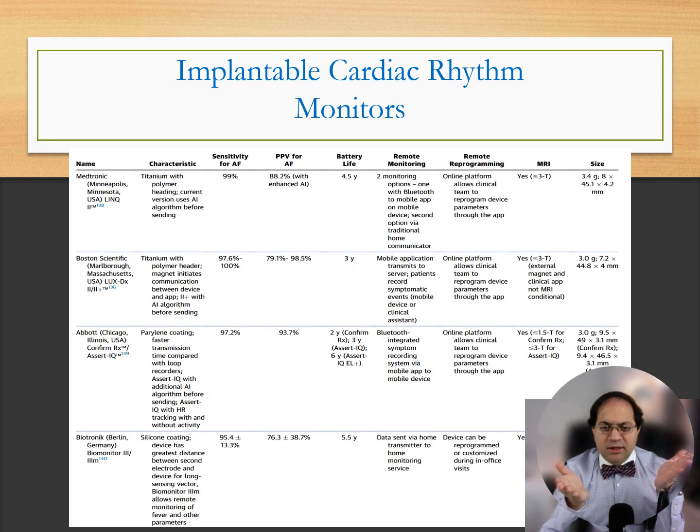And finally, we're going to talk about implantable cardiac rhythm monitors. As you see, we have 4 companies. Basically, Medtronic was a pioneer, with the Link, and Boston Scientific with the Lux, Abbott with different types of loop recorders, and finally Biotronik with the latest BioMonitor 3. They all have many years of battery, between 3 to 5.5 years. Their detection yield is very good.